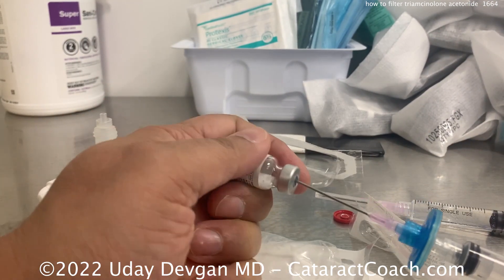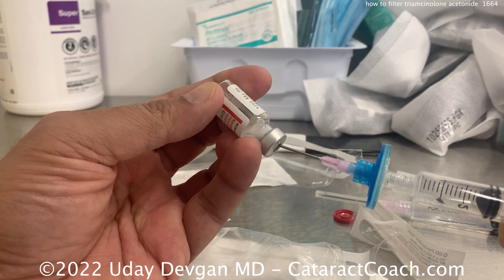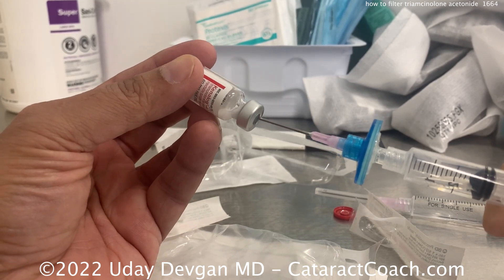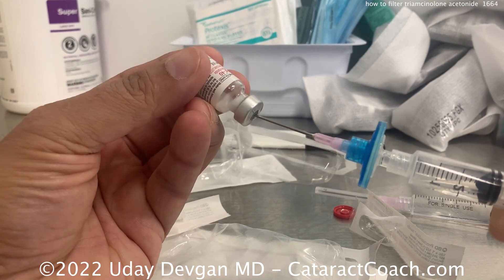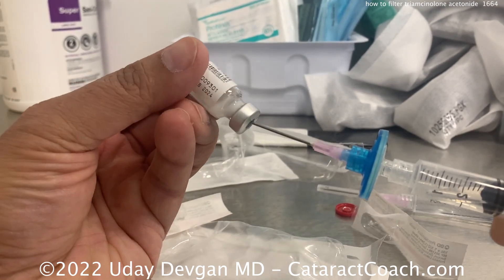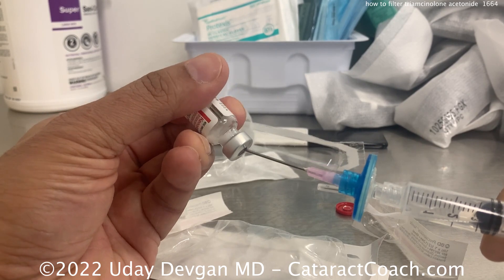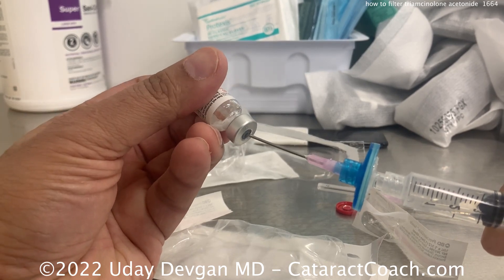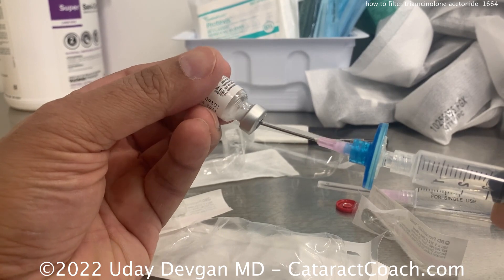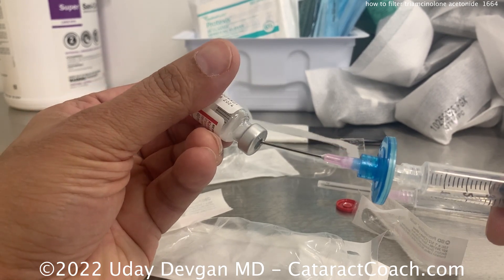I just like to make my life easy so I get the preservative-free one and we just pay the money. But I want to show you how to do this because people ask me from all over the world — they can't spend $100 on that. Remember, here in the U.S. we're used to getting almost abused on the pricing. When people find out we pay $66 for TriPan Blue Dye, they're shocked. So here we go — we're aspirating out as much as we can. You'll see in the syringe we've pulled out the solution, the liquid from that bottle. That's what has the preservatives. All the particles of Triamcinolone are still in that blue filter. Aspirate out as much as we can — now we've got all the particles in the filter.